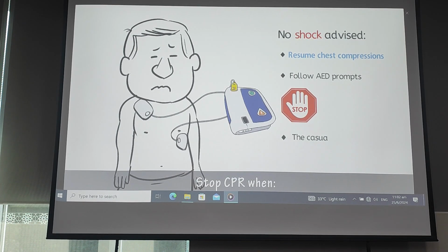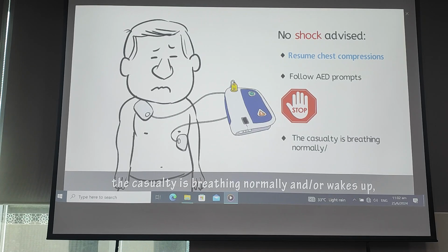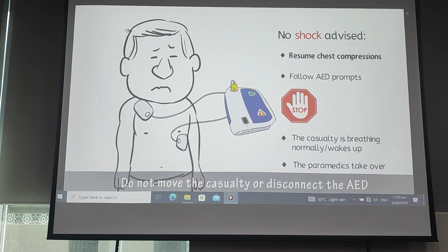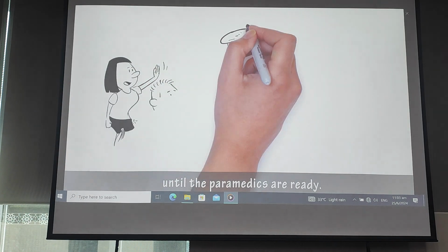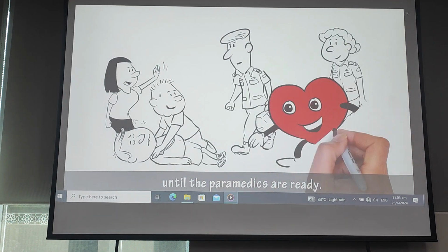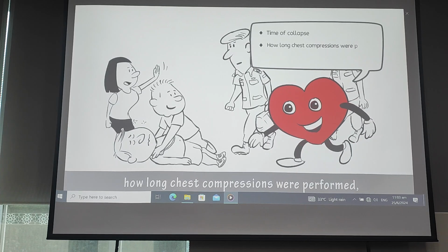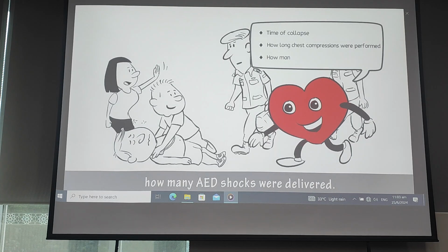Stop CPR when the casualty is breathing normally and/or wakes up. The paramedics take over. Do not move the casualty or disconnect the AED until the paramedics are ready. The paramedics may ask for time of collapse, how long chest compressions were performed, how many AED shocks were delivered.